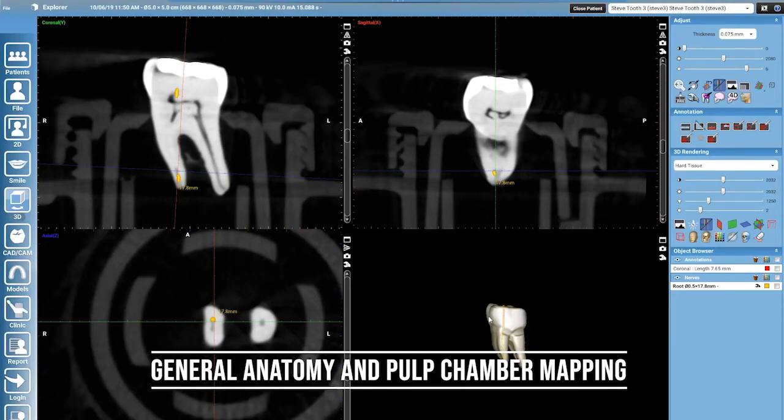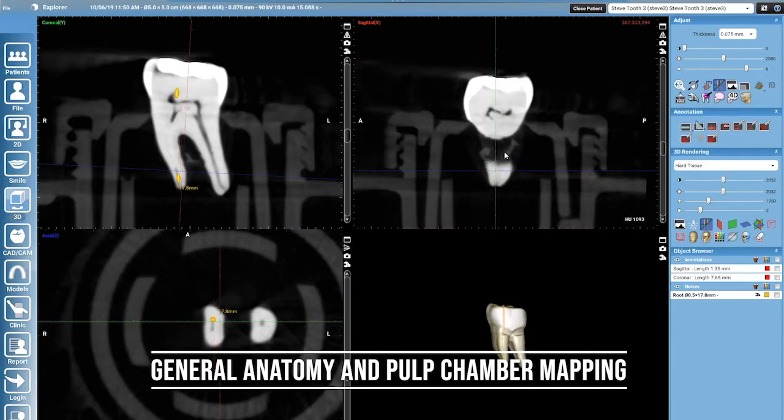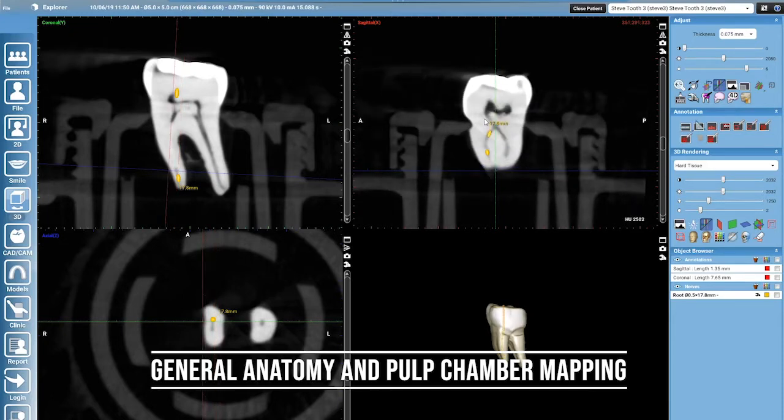First of all, you can see that this is a confluent canal in the mesial root of a lower first molar. We're just trying to get a feeling for where the confluence is and how dramatic it is. Just remember that probably 50% of all your broken files break at the confluence or at this very sharp intersection curve, mesial and lingual canals where they join.